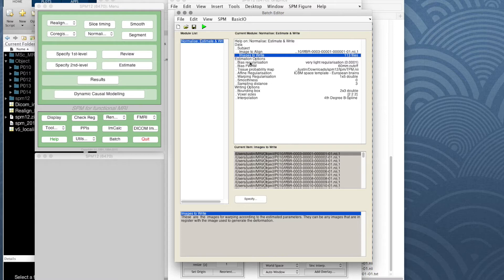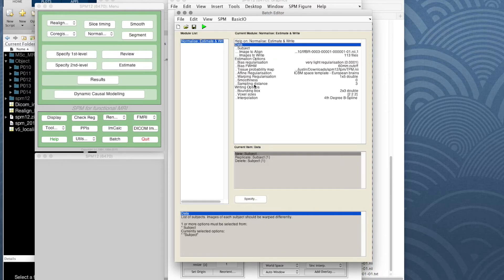We have some estimation options but we're going to leave them as they are. It's usually only when doing things with structural images that problems can occur; hopefully with these EPI images everything should work straight out of the box. But we don't just want to do one participant — we need to do all five, so let's quickly put all those in.